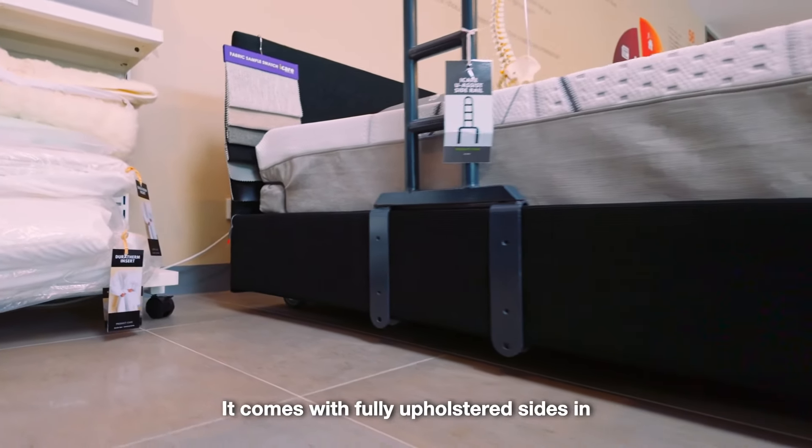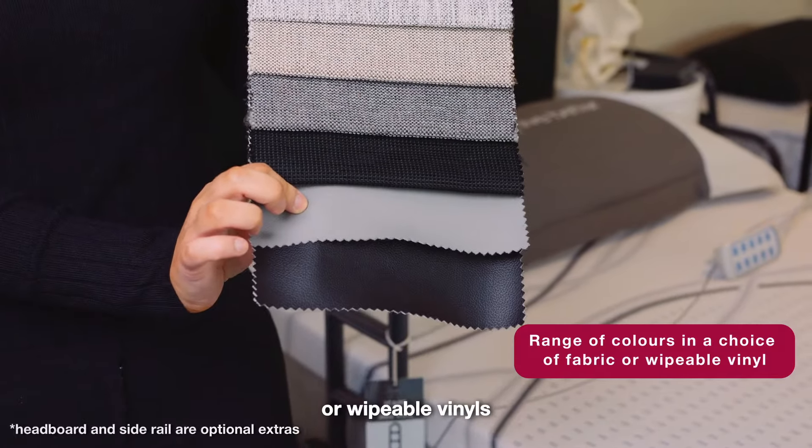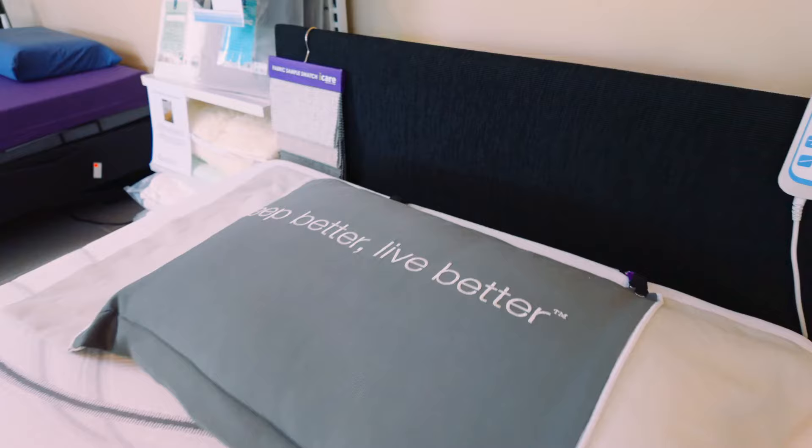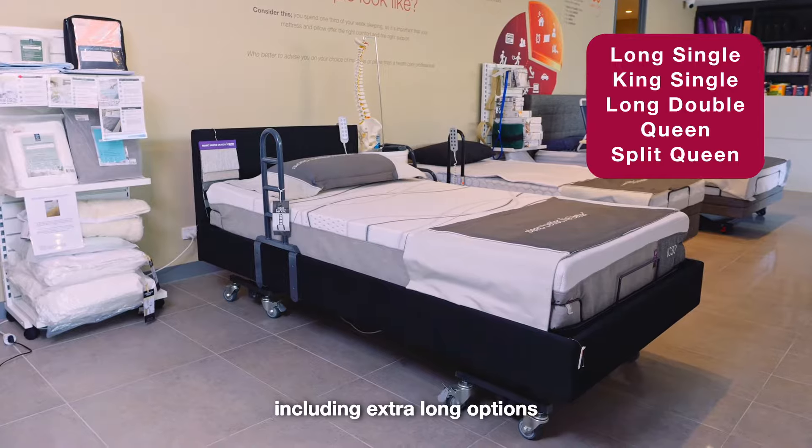It comes with fully upholstered sides in a choice of different fabrics or wipeable vinyls in a range of different colours. The IC333 comes in a range of sizes including extra long options.